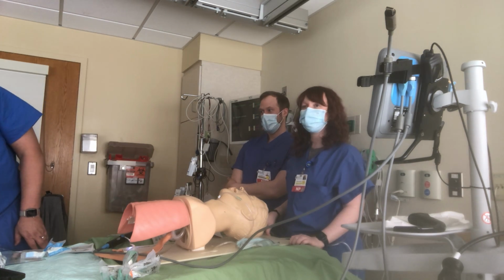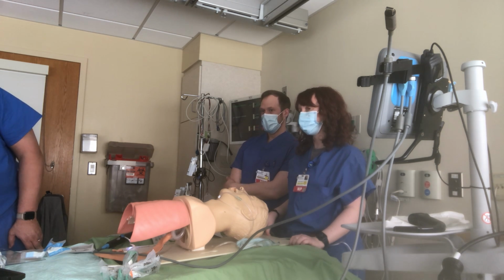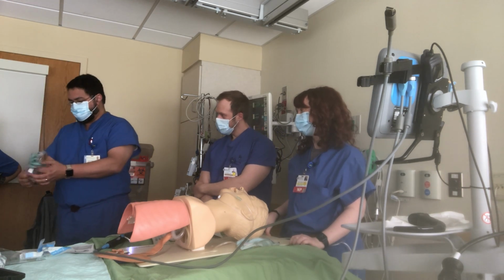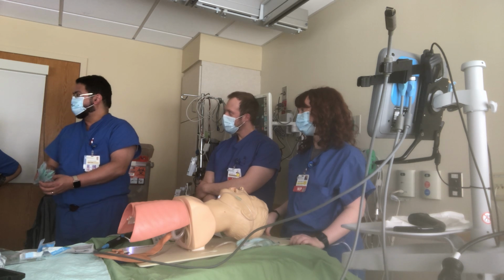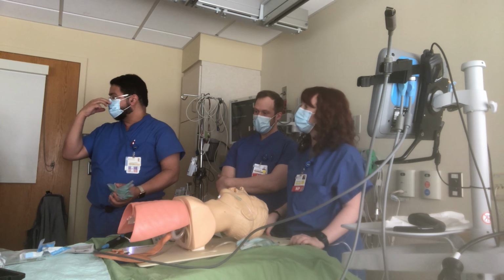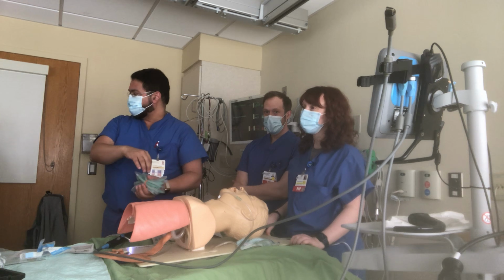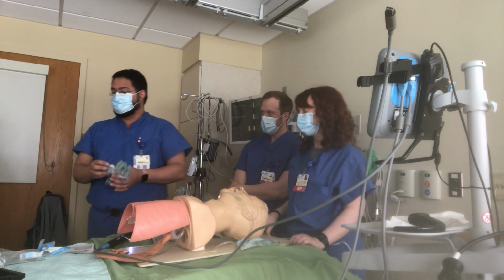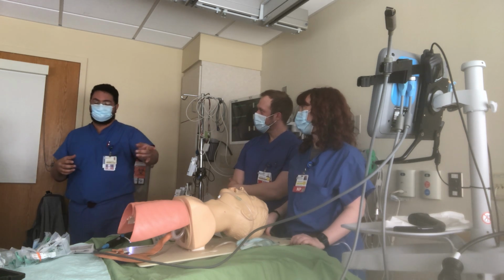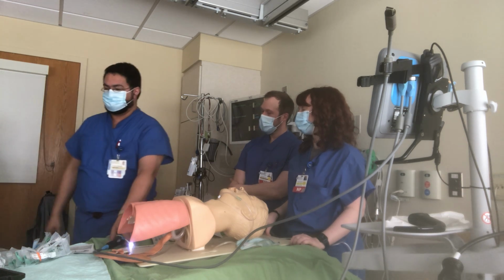So serial dilation of the nose. Can I have the nasal airways there? Do you have nasal airways? Oh, there was one here. Yeah, these are the bunch of nasal airways. So basically it starts from 28 going all the way to 36 in adult males. After I put the Q-tips for some time, then we go nasal airway and then remove it. And then another bigger nasal airway and then remove it, until we reach the 7-6. The reason we're doing all of this is because the tube itself, whether it's a 7-6 tube, is still much bigger than those airways and will just knock all of this mucosa and cause problems.